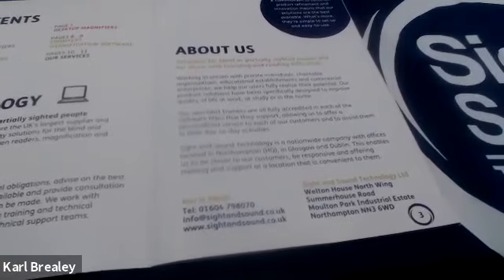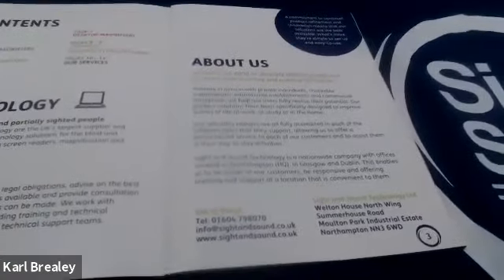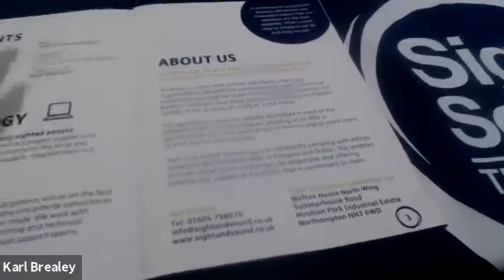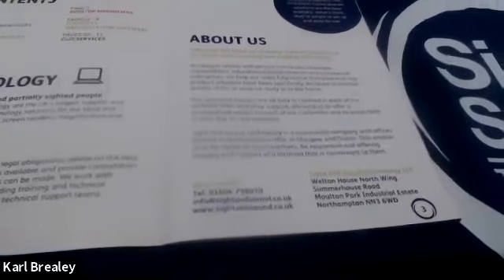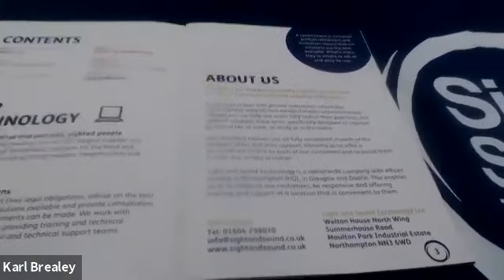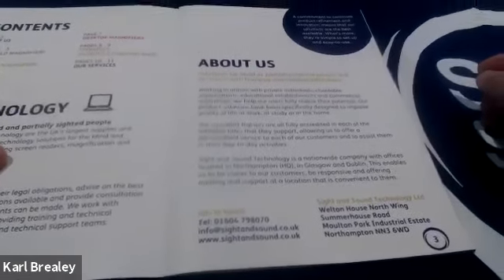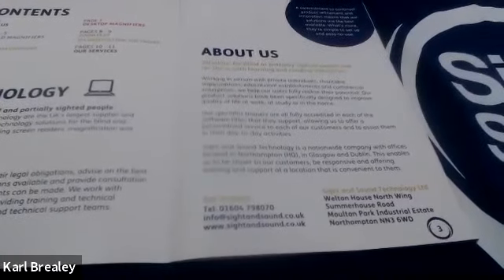Michael, Enrique, light conditions, anything. It's basically got its own built-in LED lights now. So in any light conditions, if it knows it's too dark to actually capture the image, the LEDs will come on. So in theory, if it can see something, albeit pitch black might be a little bit difficult because it won't know anything's there. But even in the darkest area.